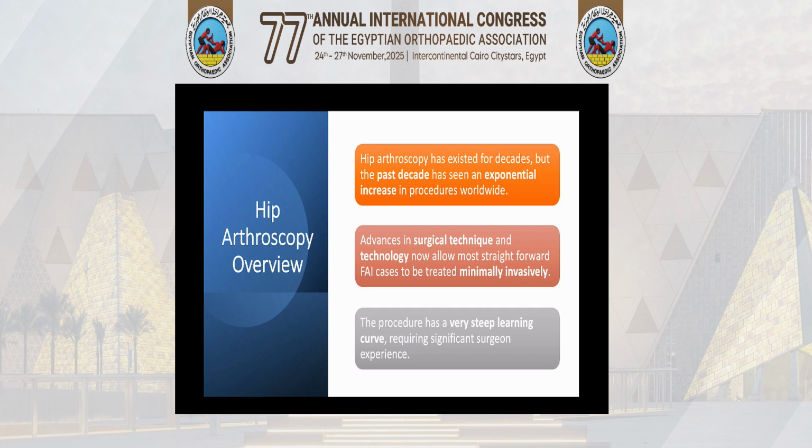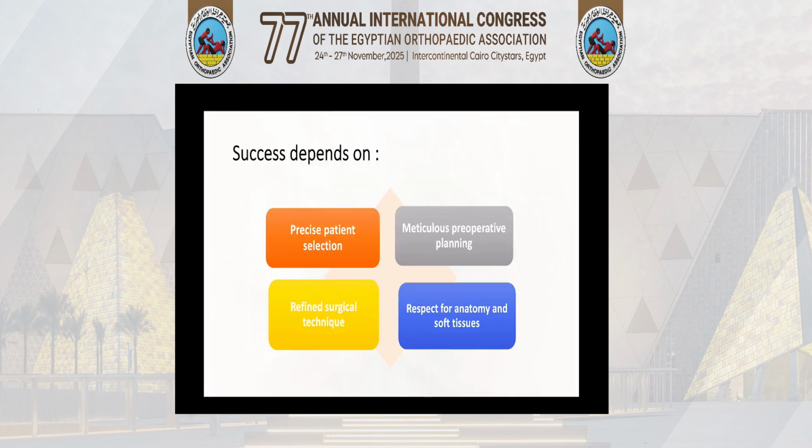Hip arthroscopy has seen an exponential increase in procedures worldwide. It's a surgical technique that gives us a minimally invasive approach to manage femoroacetabular impingement and its sequelae. The procedure has a very steep learning curve and requires significant experience.